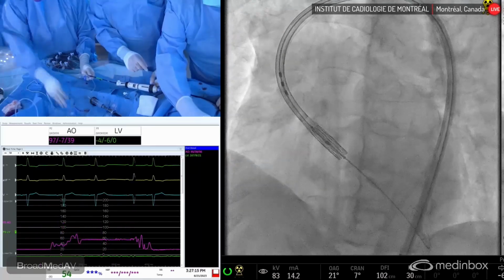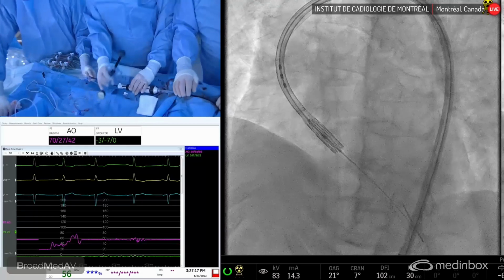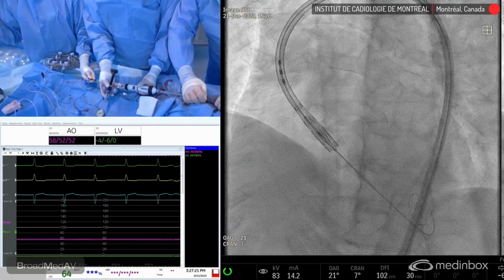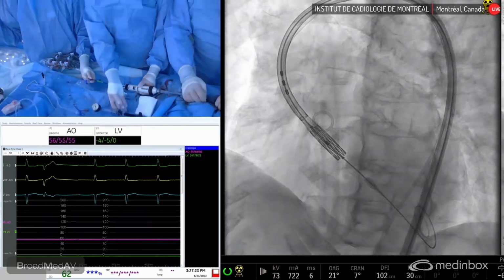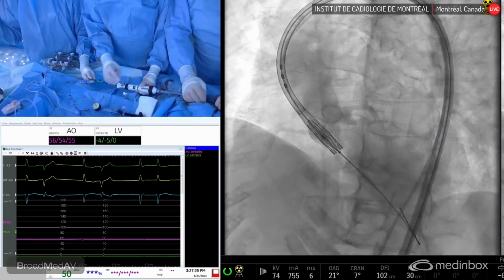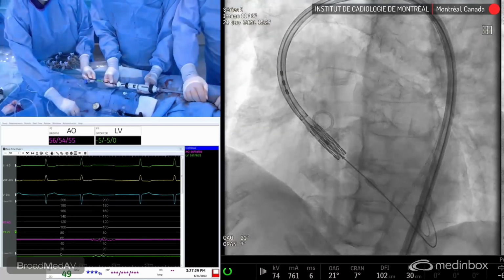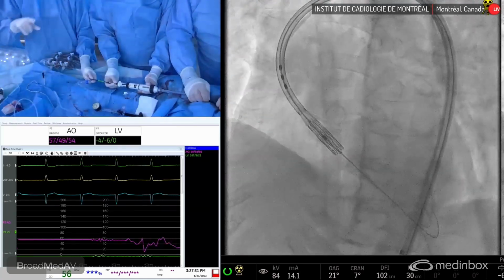Okay. Let's... Parfait, merci. Okay. So, Cine, when you're ready, I'm going to shoot. Okay. Cine. Okay. We'll take an image. Avancer un peu. So I might advance it a little more. I find it a little bit high.